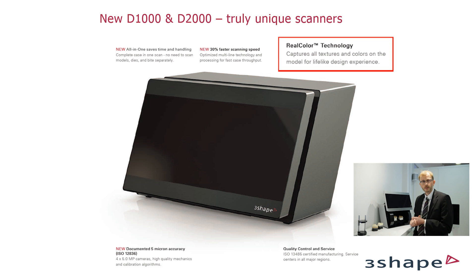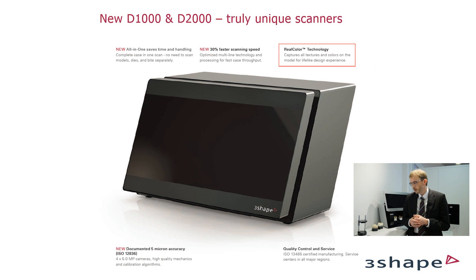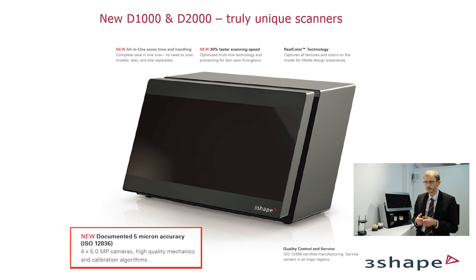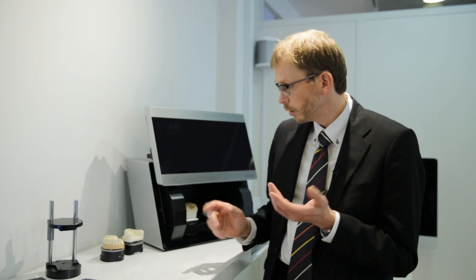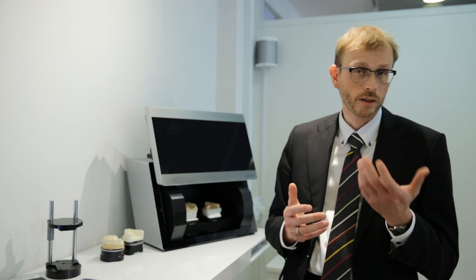With these scanners you also get the real color technology that we introduced with the D900. And we really have high accuracy — there is an ISO standard called ISO 12836, and with that standard these scanners, the D1000 and the D2000, actually achieve 5 micron accuracy. The accuracy of the other scanners is also very, very good.